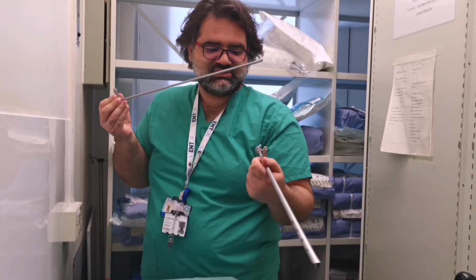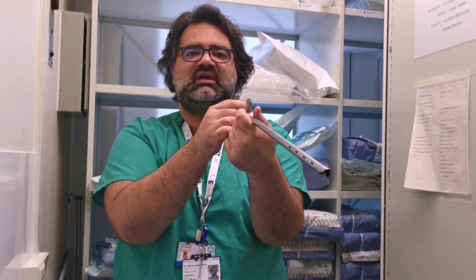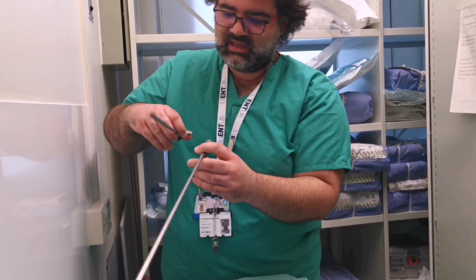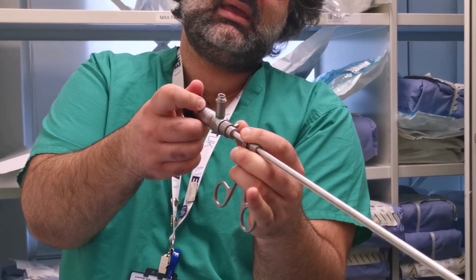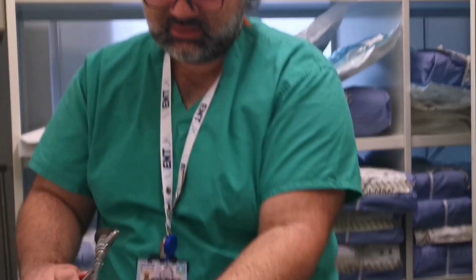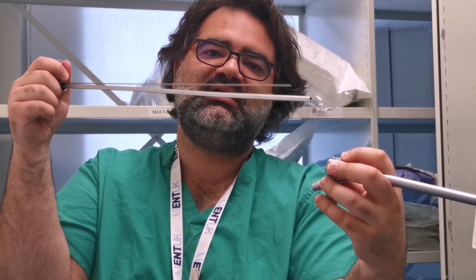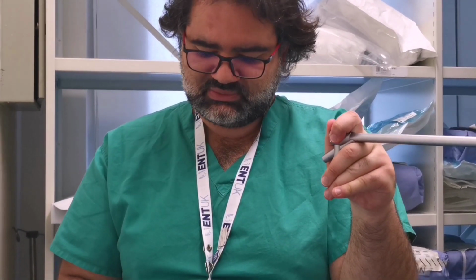So we have our lens, so that's essentially all still connected to essentially ventilating the patient. Essentially plug it with their finger whilst you're setting up the optical forceps. So to set up the optical forceps, again, everything is still pointing up, so it goes like this, and then to lock it again, you just have to go up, so it's still now locked. So now it's part of the optical forceps, okay? And for the ventilating bronchoscope to fit everything together, we have to remove everything along with the light carrier that we had, okay? And now the surgeon can plug the airway for ventilation whilst we are setting up.